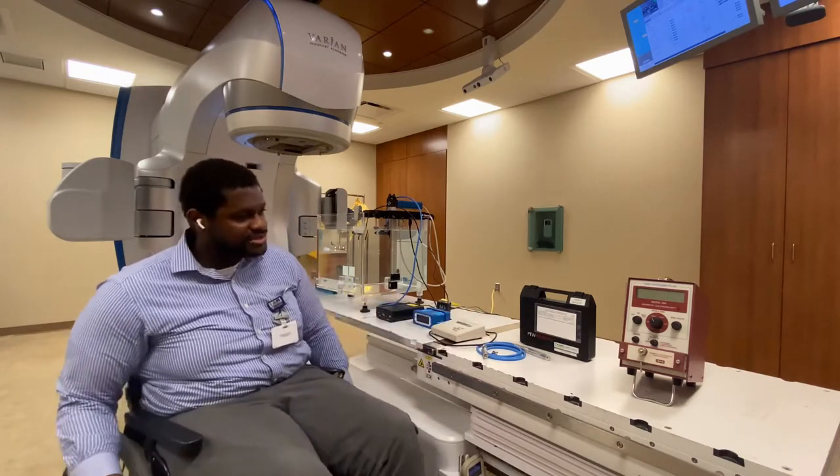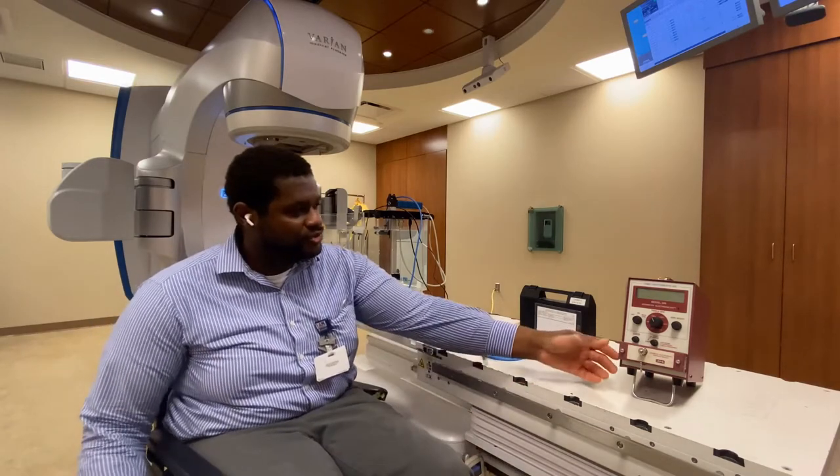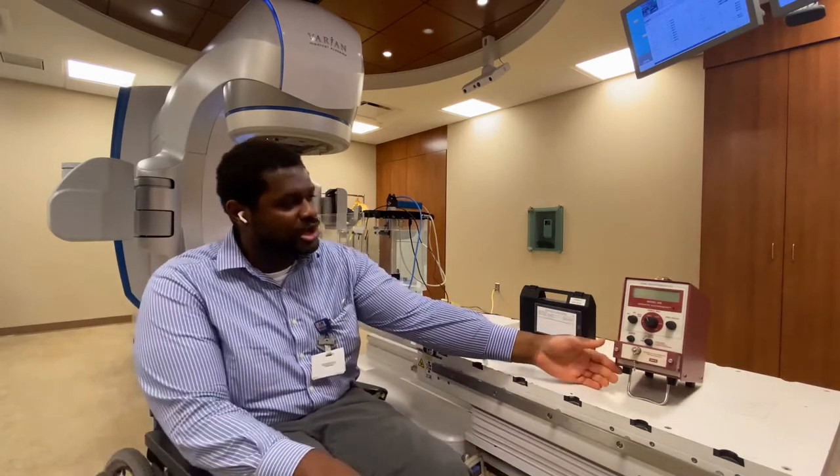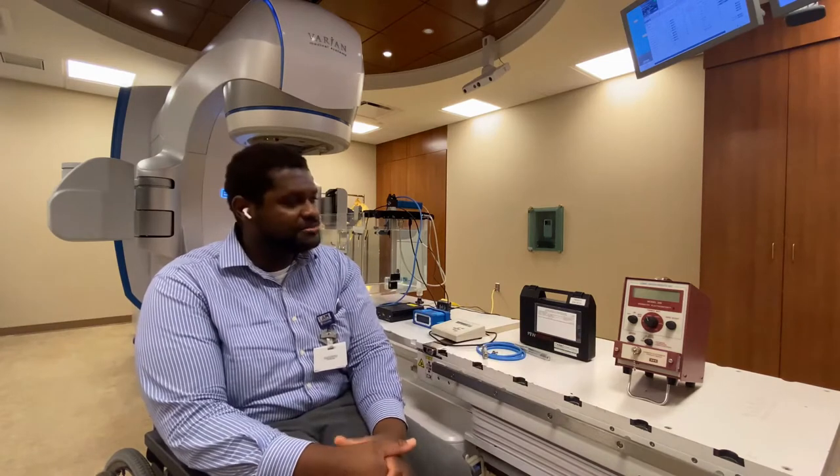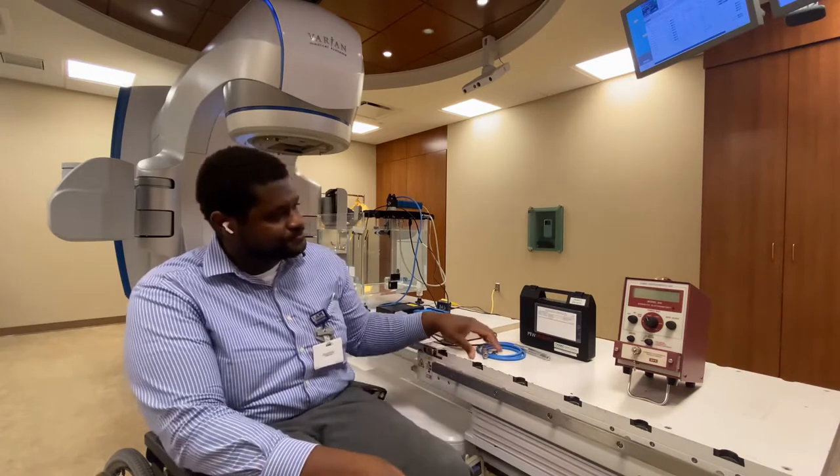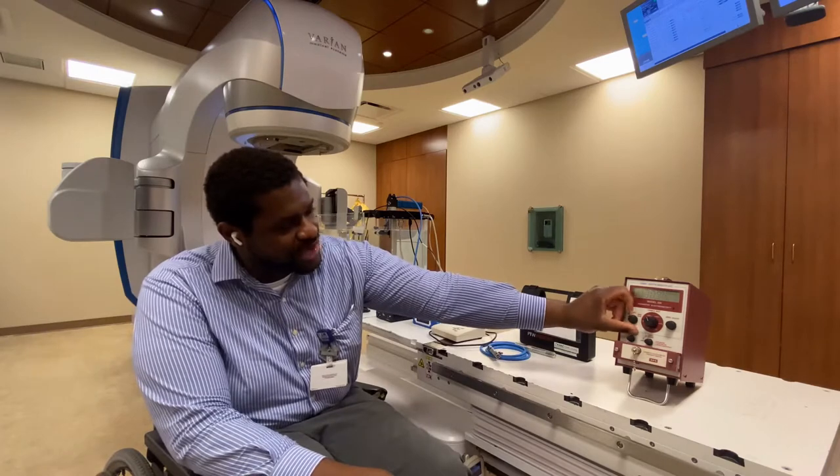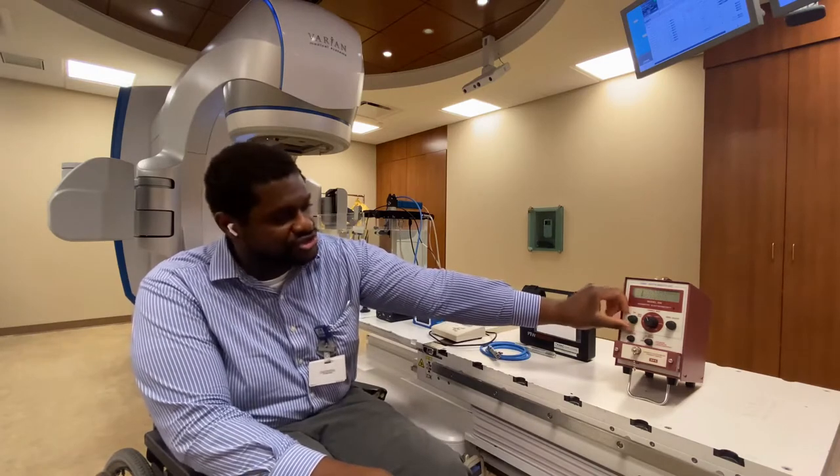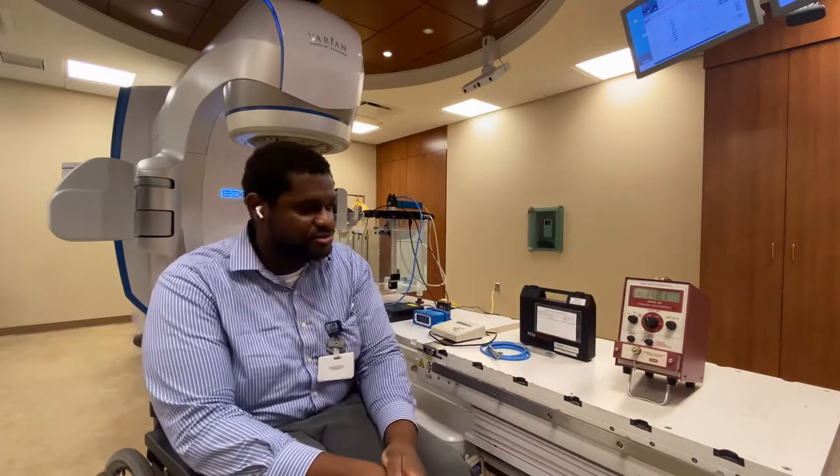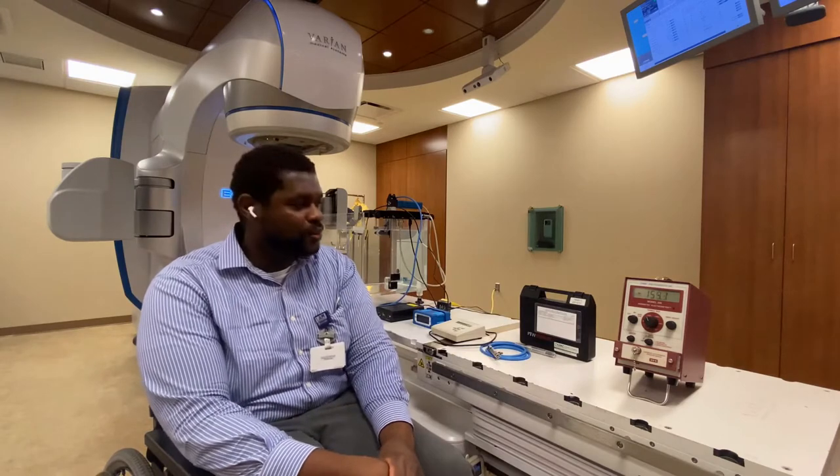One thing to note about the electrometer is if you set your bias to minus 100 or plus 100, that essentially means that you're at full collection for plus or minus 300 volts. One quick thing to do is to ensure that you set it to the correct voltage. You can also do a check bias which essentially will tell you what bias that you're set at. Let's begin.